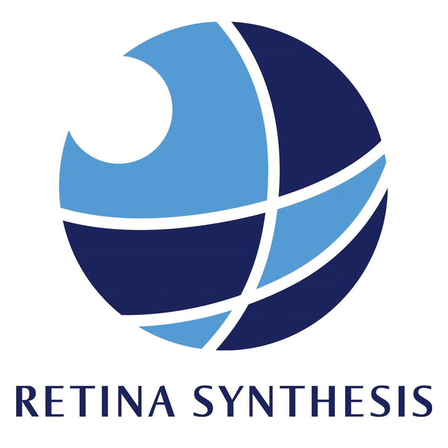Really good. So at angiogenesis, I reported on the quality of scans. It's an arbitrary scale from 0 to 7, and anything 2 and above is high enough quality to see fluid. And 7 is the highest quality scan. And in fact, a lot of the scans were very, very high quality. And they have to be high quality in order for the artificial intelligence algorithm to work. And that algorithm requires a score of 2 through 7.